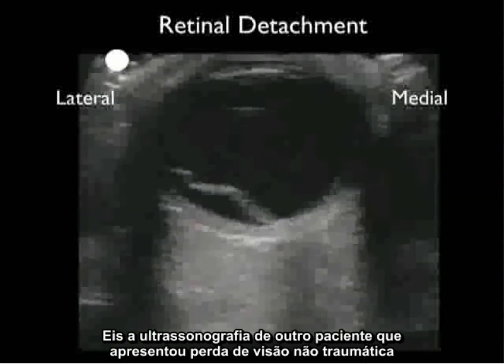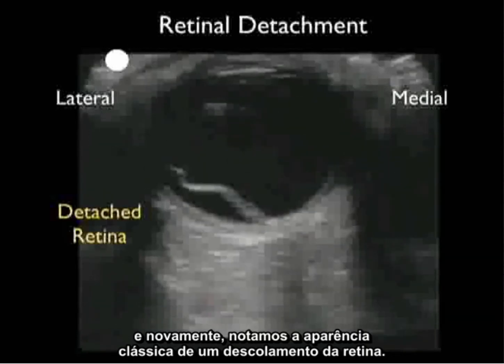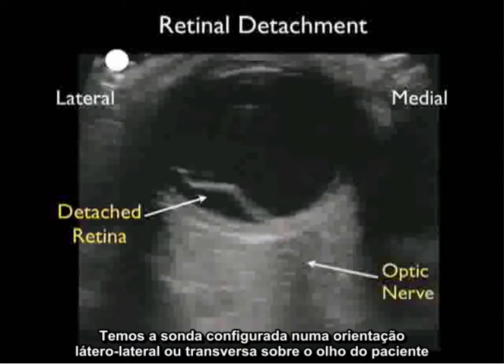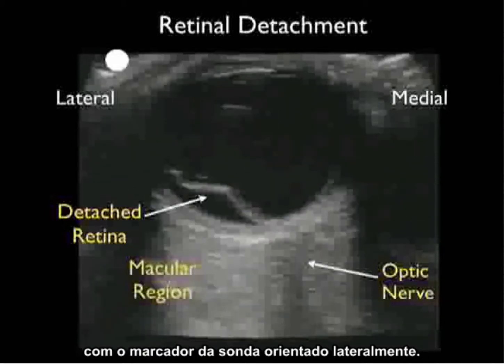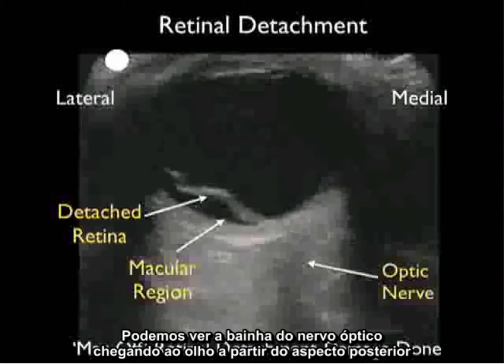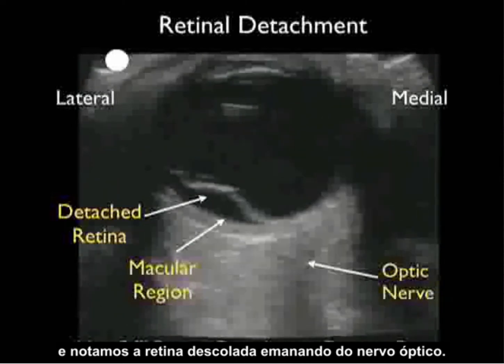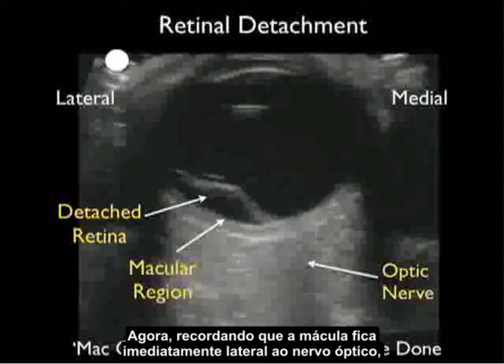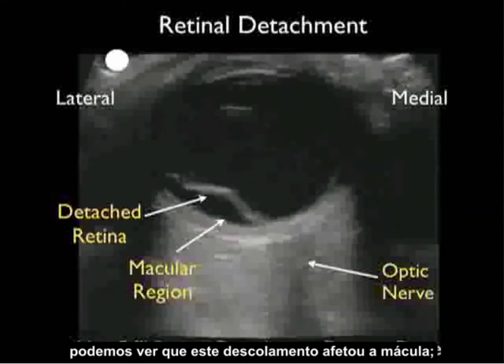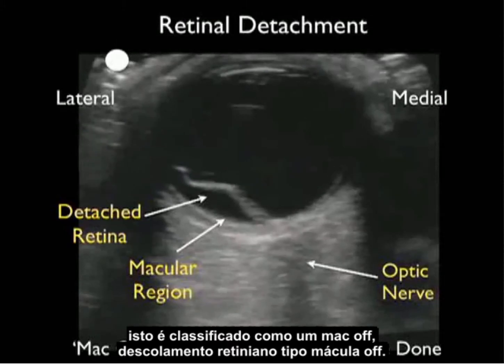Here's the ultrasound from another patient who presented with non-traumatic loss of vision, and again we note the classic appearance of a retinal detachment. We have the probe in a transverse orientation over the patient's eye with the probe marker oriented lateral. We can see the optic nerve sheath coming up from the posterior aspect into the eye and the detached retina emanating off from the optic nerve. Recalling that the macula lies just lateral to the optic nerve, we can see that this detachment has affected the macula — classified as a mac-off or macular-off retinal detachment.